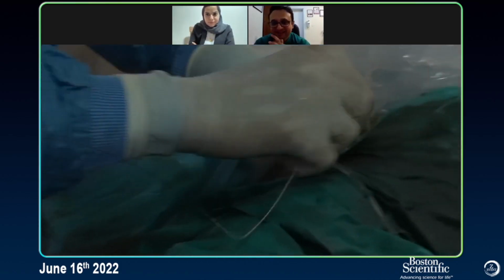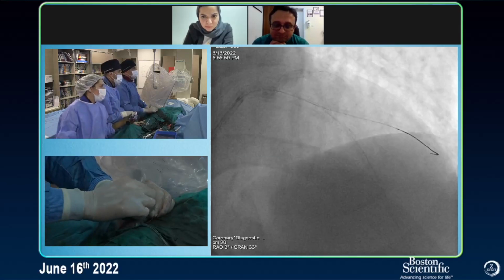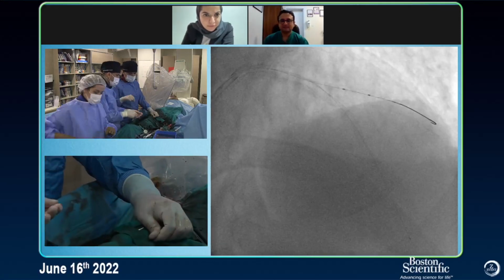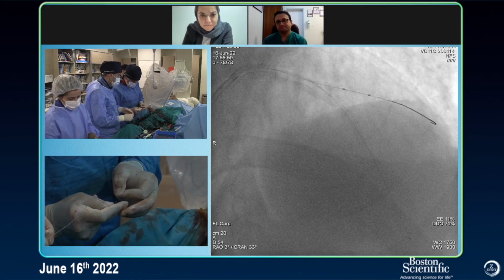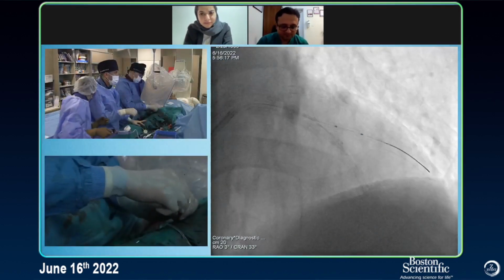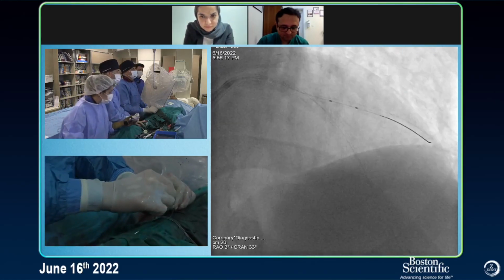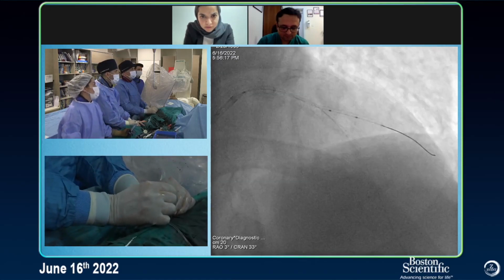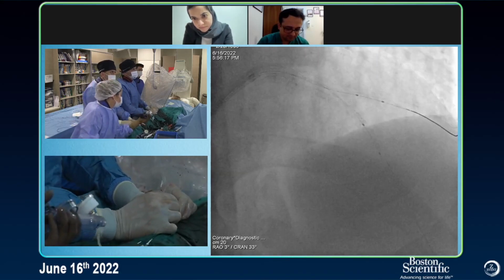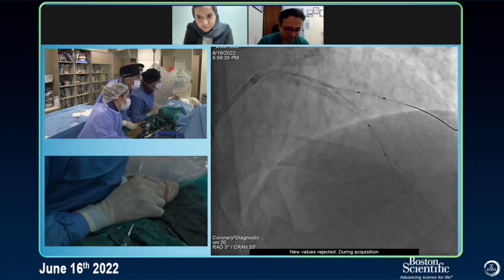3.75. Just 10, 12. Okay, not 3.75, 3.5. Ready, 3.5. Good, I'm giving 3.5. So this is the 2.5? 2.75. What is this? 3.5. Will it pass here? Yes. It passed. Okay, let's do gentle. Go to 8 and later 10, okay? There is more.